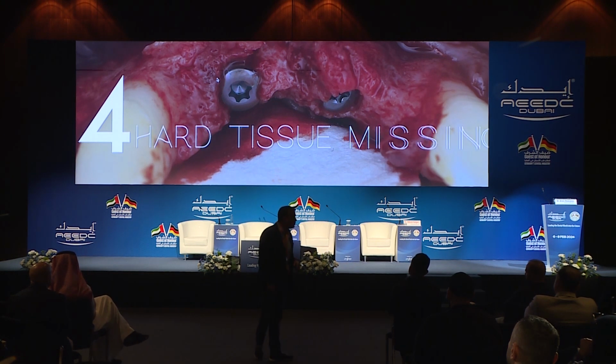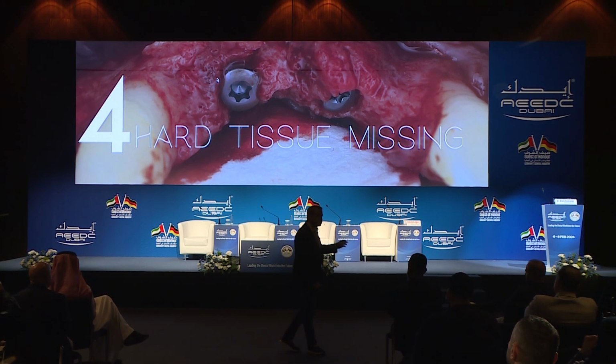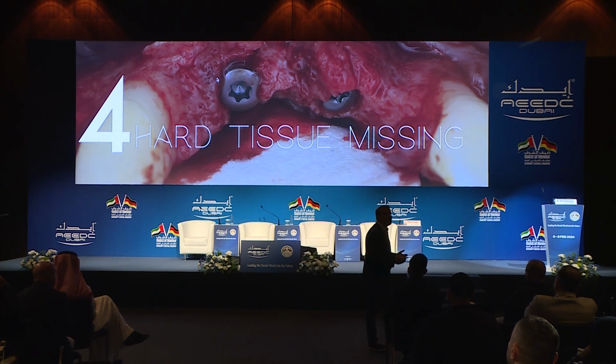If you have no bone, my friend, send the case to Portugal. They visit Porto, it's a lovely city. I love it. And then they can do the bone graft at the same time. So don't place the implant if you have no bone.